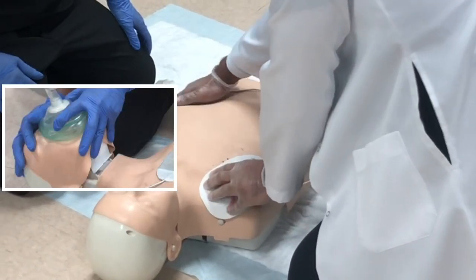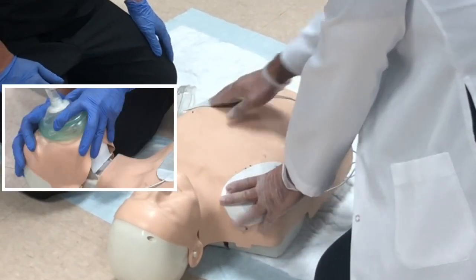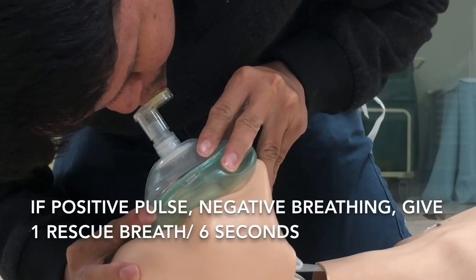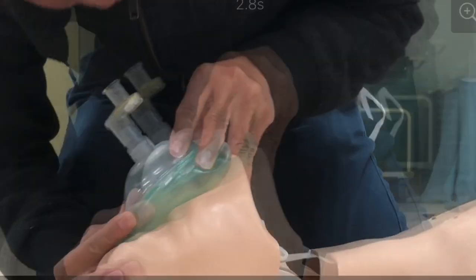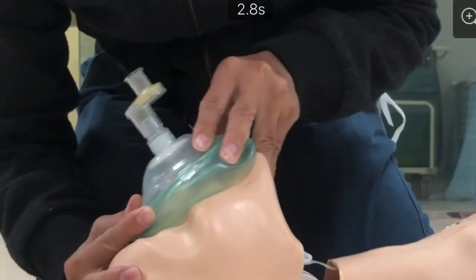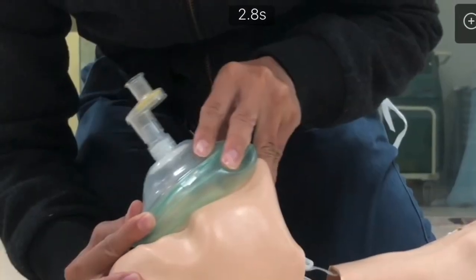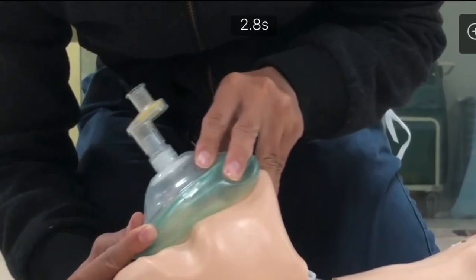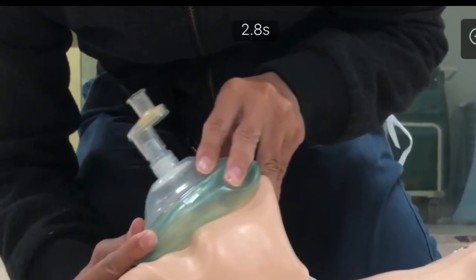Positive pulse, negative breathing. Give one rescue breath every six seconds. One, two, three, four, five, six.